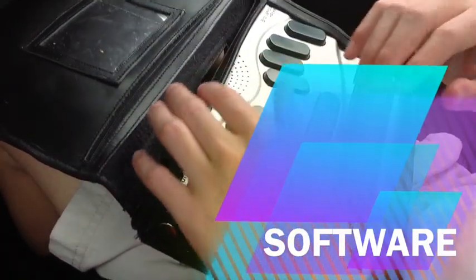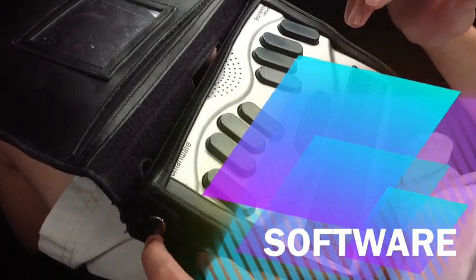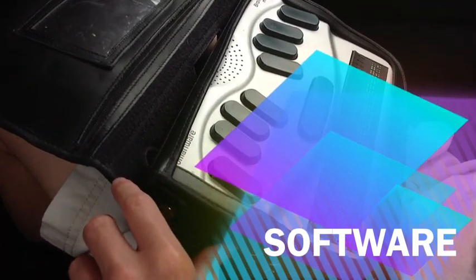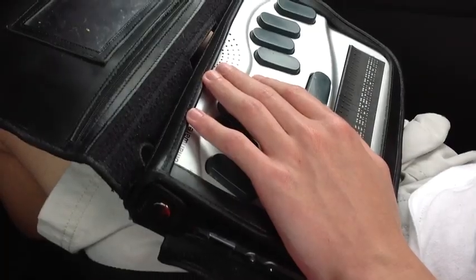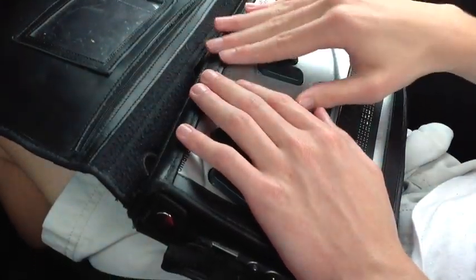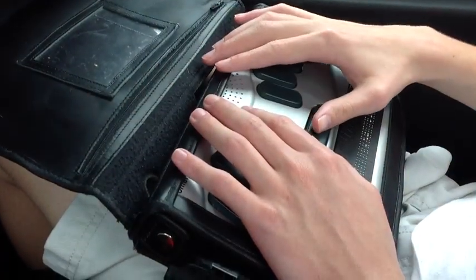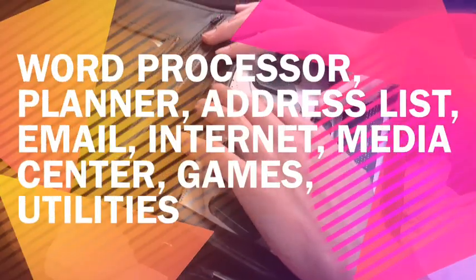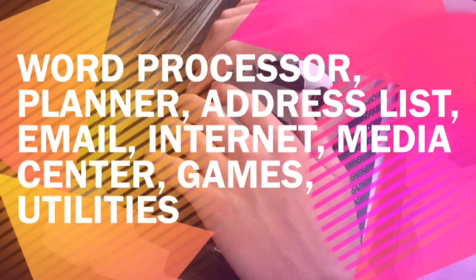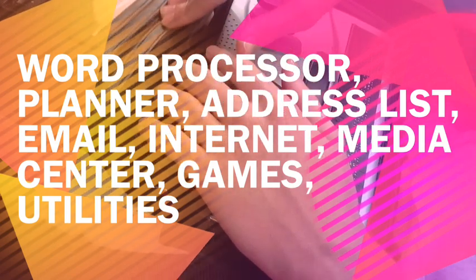We've spent too much time on hardware — we've only got about 10 minutes left at the very max. Let's go option by option through the main menu. The BrailleNote MPower has very powerful programs. First, the Word Processor — it has very powerful document capabilities, pretty much like a full Microsoft Word almost.